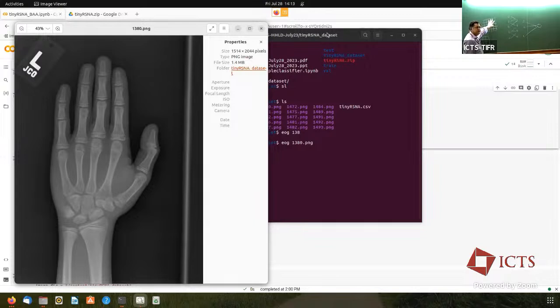Slide the kernel over to the next one, get the next set of values. Slide. Basically, applying the kernel onto the image results in a new image. That new image is the convolution of the kernel and the image. So it's a sliding window of weights that you apply and slide over your image to produce an output.